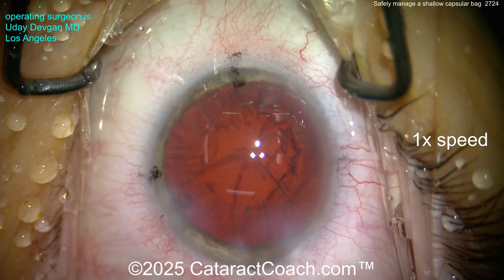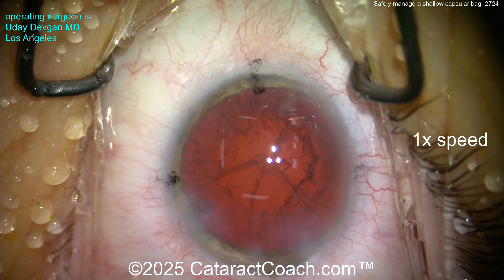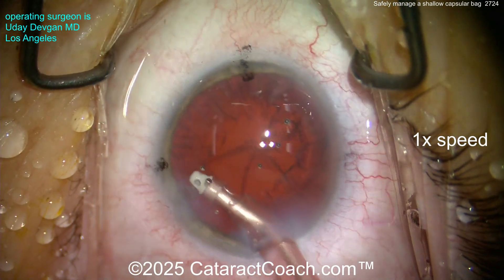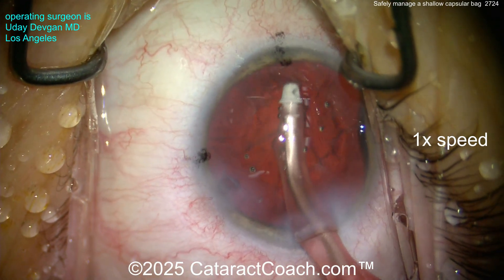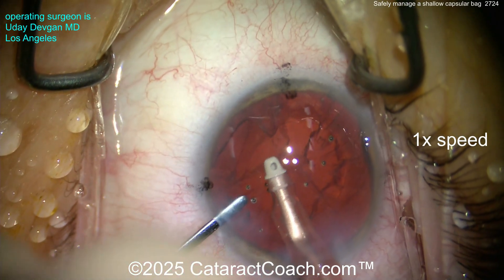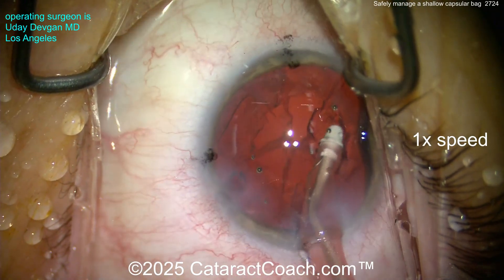The posterior capsule comes forward and touches my chopper. The bag is so shallow that the posterior capsule comes up to the back side of my chopper. Why? Loose zonular support means zonular laxity, meaning there is fluid flow — BSS going through the gappy zonular support into the anterior hyaloid space, right into Berger's space in front of the anterior hyaloid face. That's going to shallow the bag out.